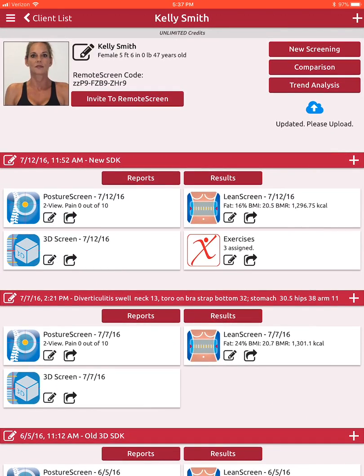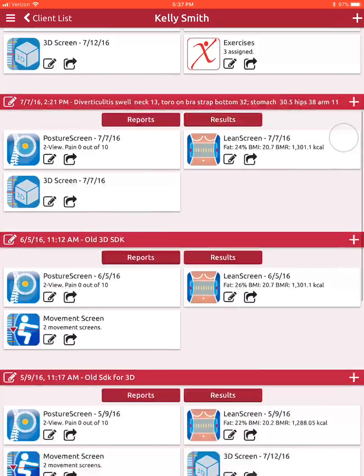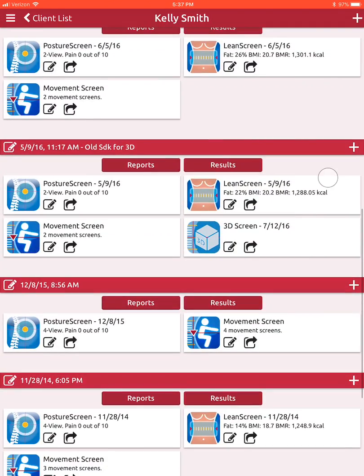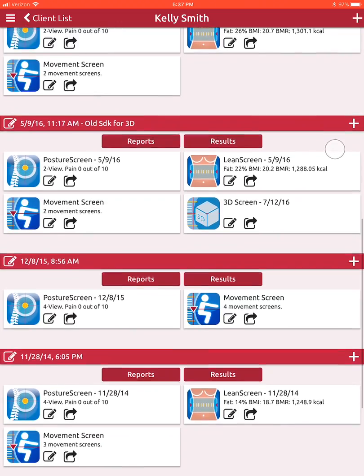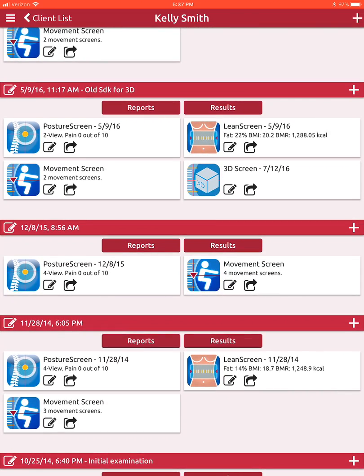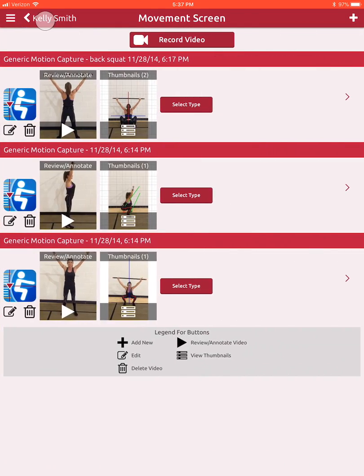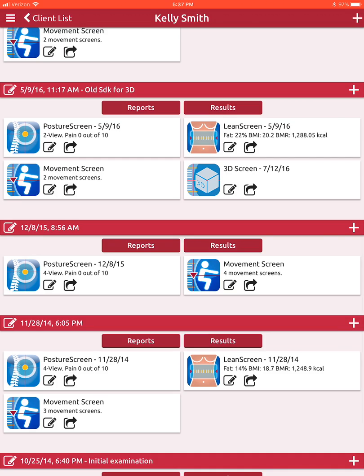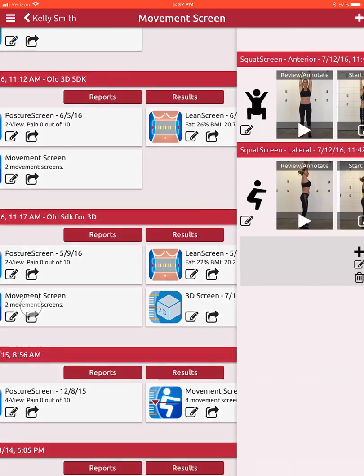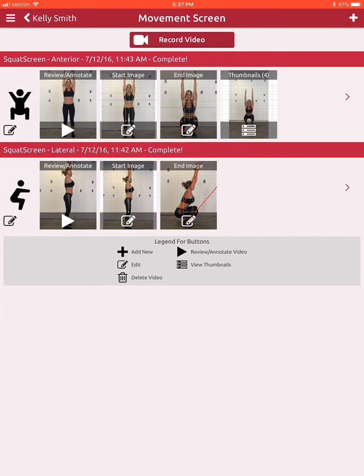In this tutorial we're going to walk through how to prescribe corrective exercises using a movement screen. This requires a web exercise account, and once you have the analysis done, in this case we're going to show a lateral view of a squat assessment.